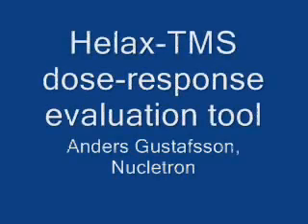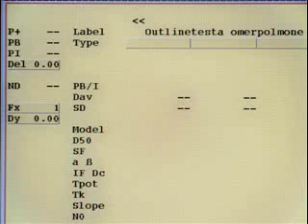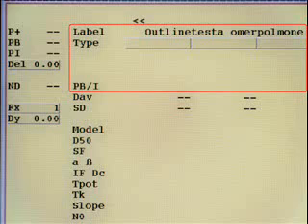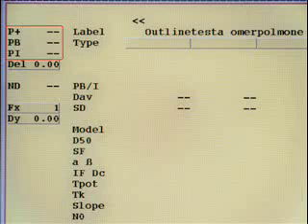This is a short introduction to the dose-response evaluation tool in HELAX-TMS. The tool provides a convenient way to calculate TCP and NTCP values for individual tumor volumes and risk organs, as well as composite control and complication probabilities, and ultimately P+, the overall probability of local tumor control without severe normal tissue complications.